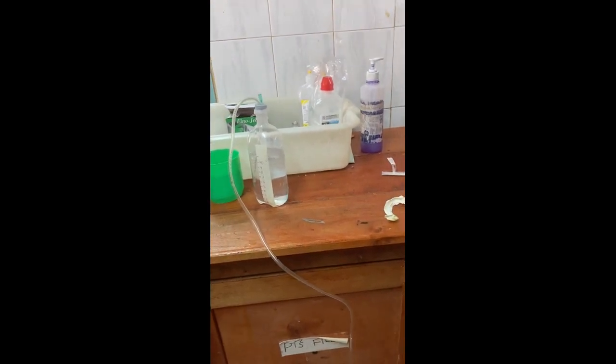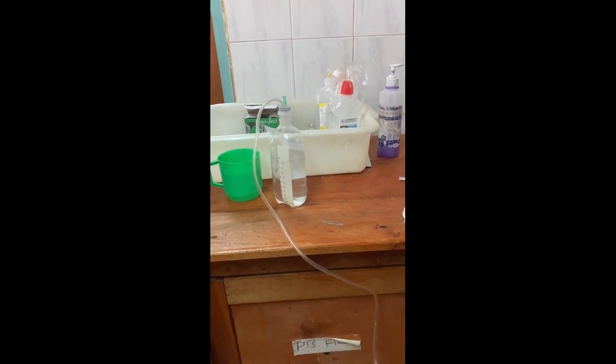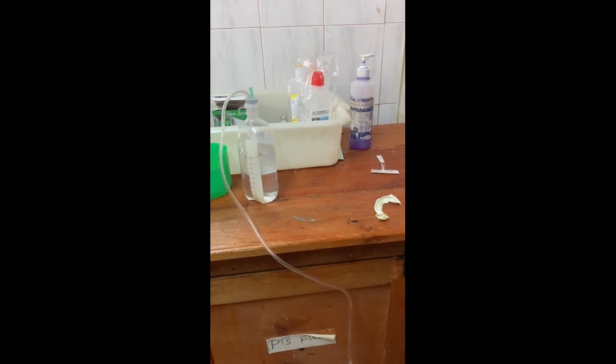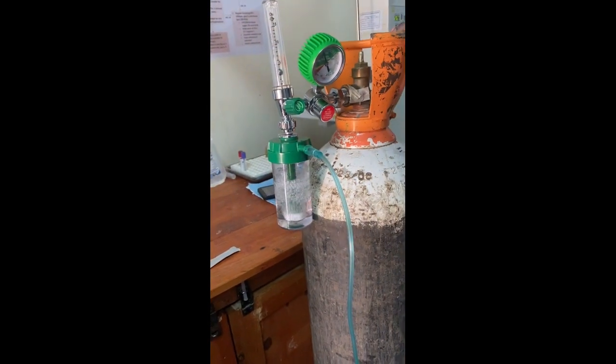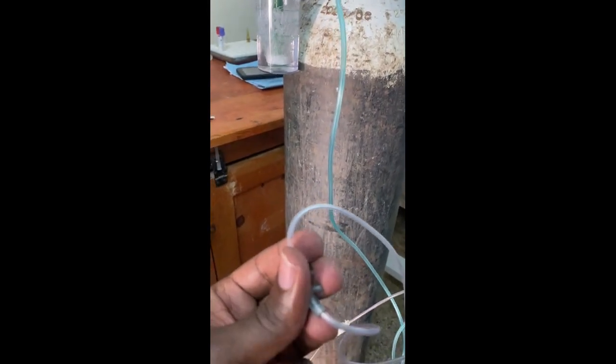And how it started bubbling. Just one more thing that I realized: if you place the NS bottle at a certain height, the water flows back into the prongs, and this can actually suffocate the baby. So it's best if you put it lower than the baby, and that's what we did in the end. But otherwise, thank you so much.